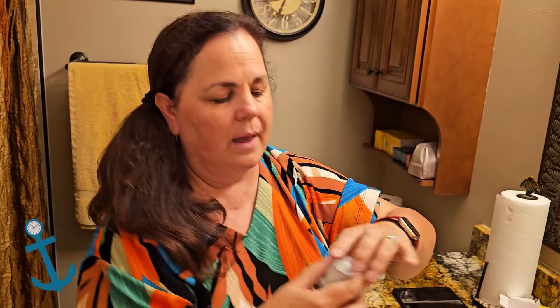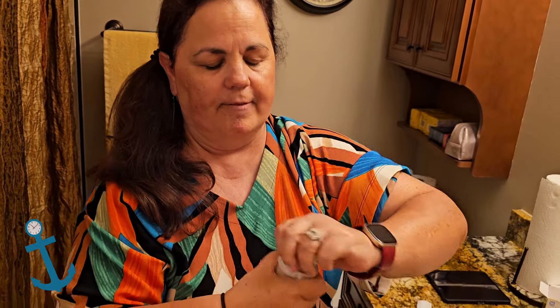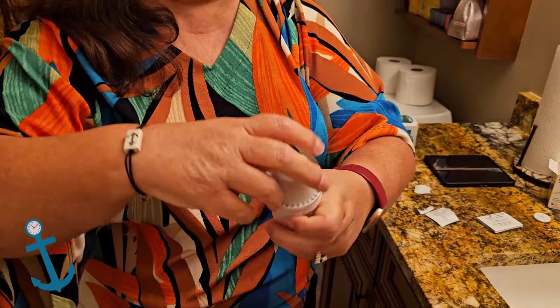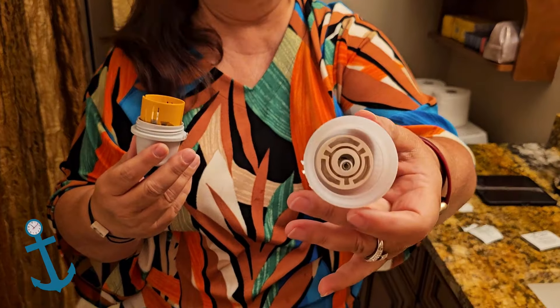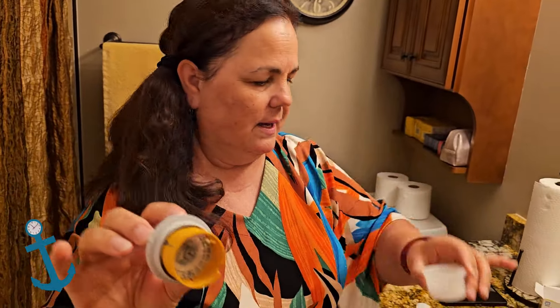I'm going to let it dry a little bit, fan it out, and while that's drying I'll open this — I just have to twist it. Wow, it is really on there tight. Twist it — we're trying to twist it the wrong direction, maybe. Okay, that's what the lid looks like. My sensor is in this part.